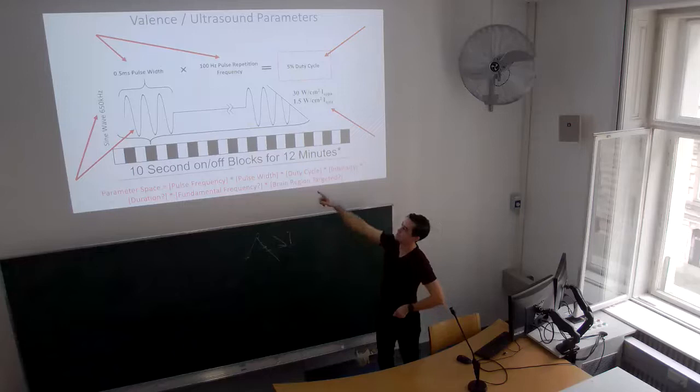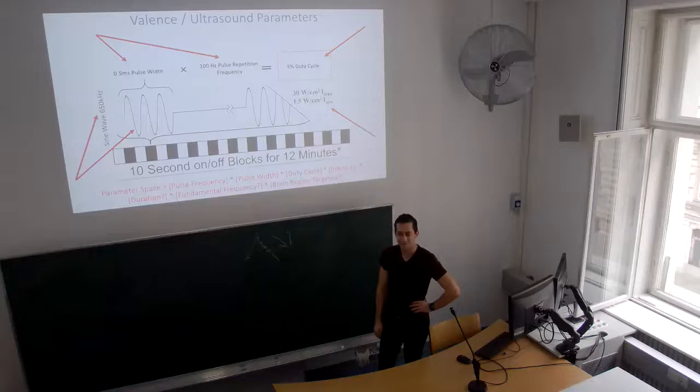Super question. So it's essentially a half millisecond pulse per 10 second block. But then you do it once and then there's a 10 second... No, it happens 100 times a second, so it's 100 hertz. So there's some off period, and then you have a full 10 seconds where you're not pulsing at all. Oh, I'm sorry, I didn't explain this. You're right. I should have cut this out probably.